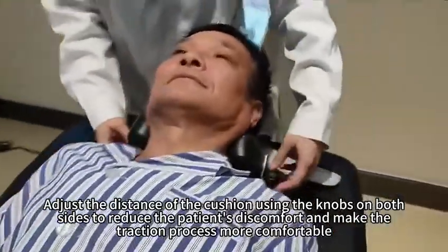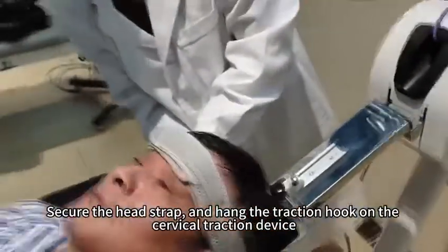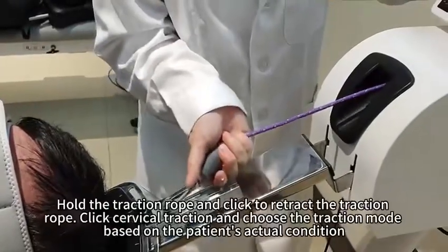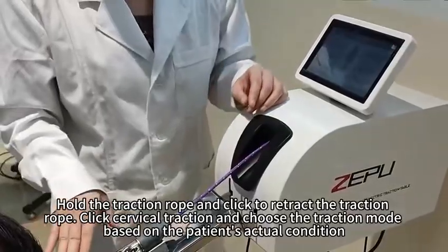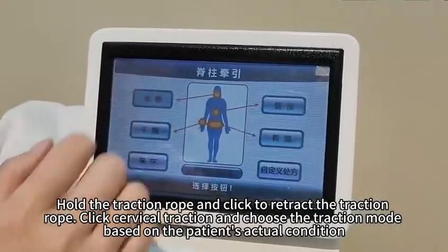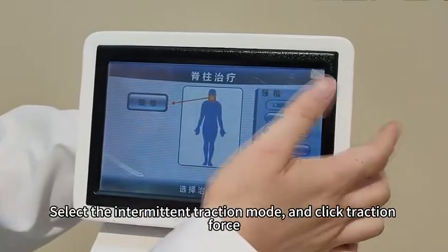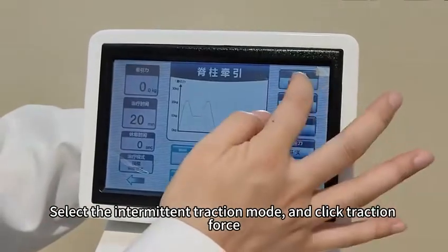traction process more comfortable. Secure the head strap and hang the traction hook on the cervical traction device. Hold the traction rope and click to retract the traction rope. Click cervical traction and choose the traction mode based on the patient's actual condition. Select the intermittent traction mode and click traction force.